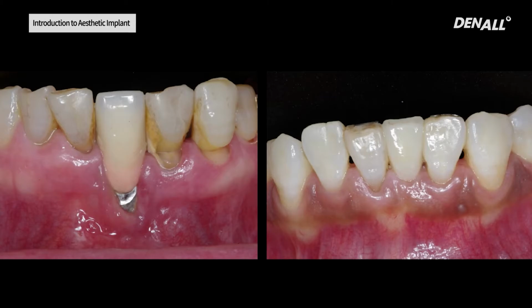If you look at the surrounding area, it is not obvious where the implant lies. The biggest difference between the left and right, of course, is pre-op evaluation, which is very important. Based on the evaluation, accurate implant positioning plays a very important role. The implant on the left is placed very deep. Do you think that was intentionally done? I believe it was because there was a problem.